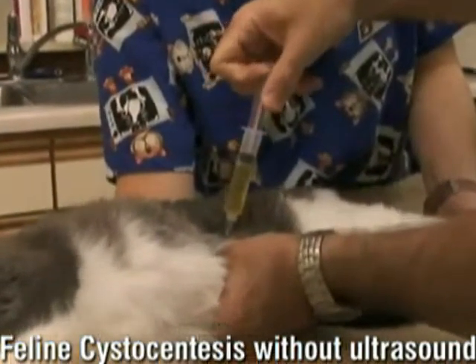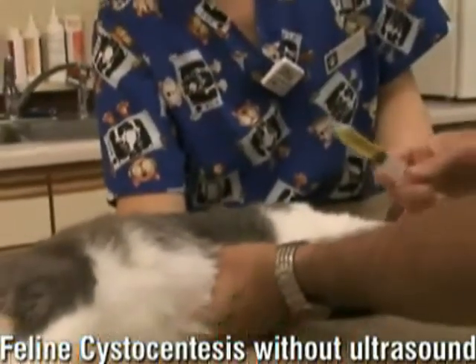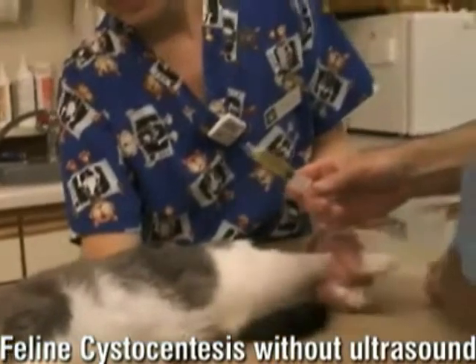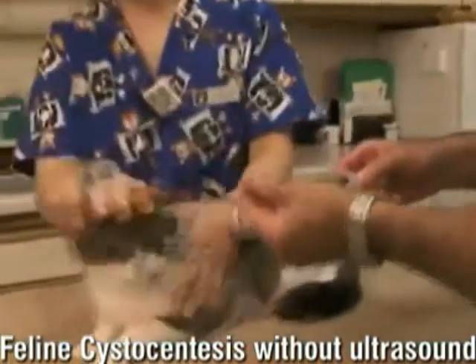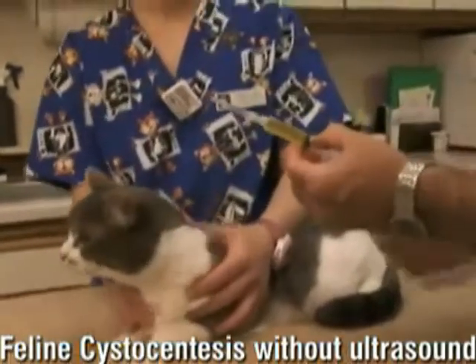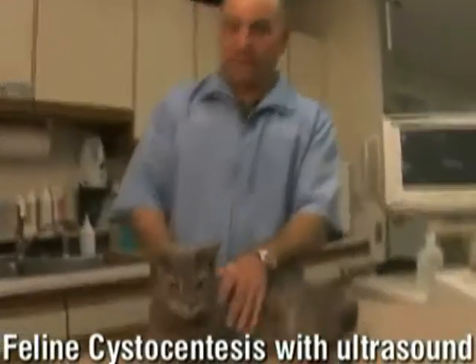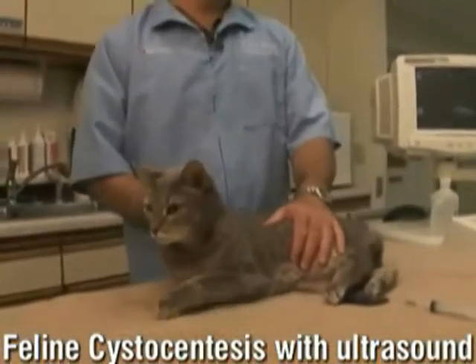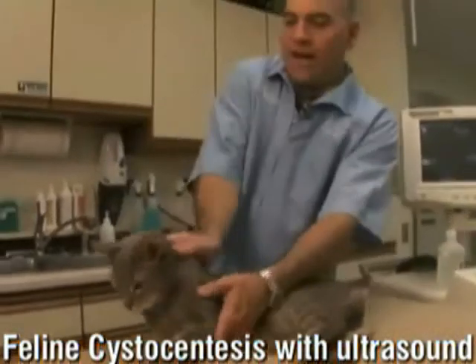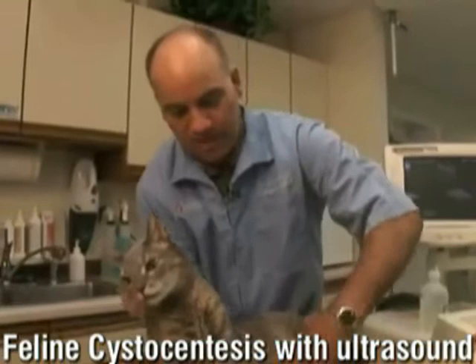If we have ultrasound it makes it a lot easier, but if you don't, you can still do it. I can feel the bladder right there. Here's our urine sample. We're going to really try to get between 4 and 6 milliliters if we can. We don't want to press on the bladder anymore — we just want to leave it and let her go. So that's urine collection in the cat without ultrasound. We've got a nice 5 milliliters of a very nice sample.